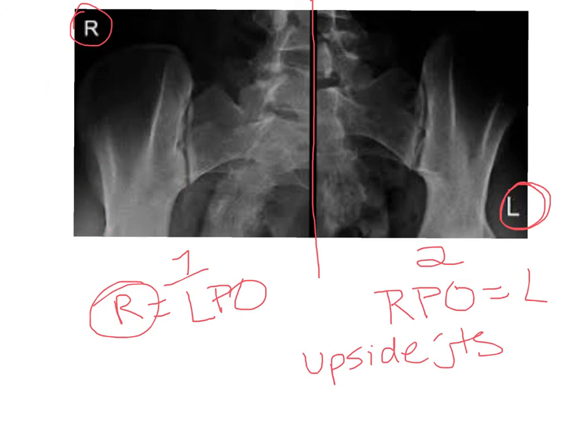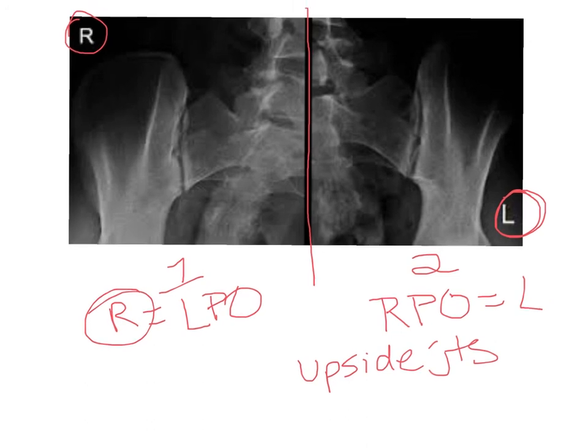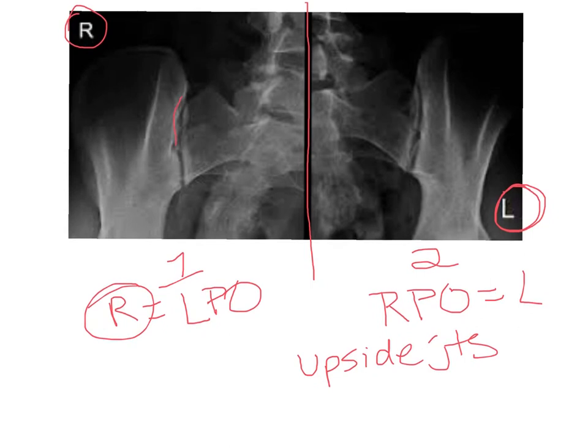As far as anatomy goes, we've already been through most of the anatomy here. These aren't the greatest images to look at. You have your right SI joints coming through here, your iliac crest, pelvic brim. This is the wing or ala of the sacrum here. Now remember, these are two separate projections, okay?